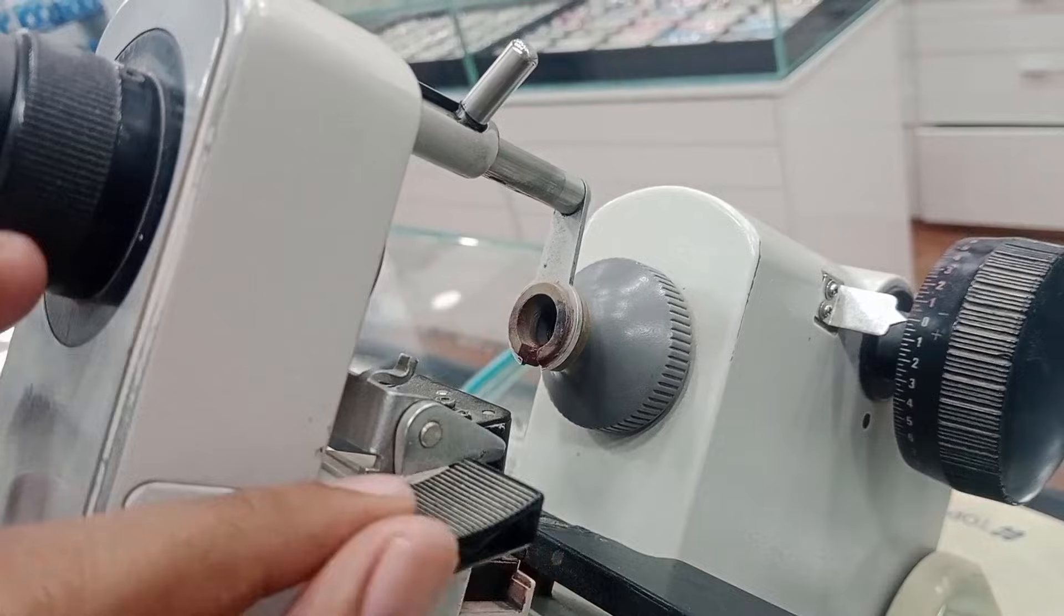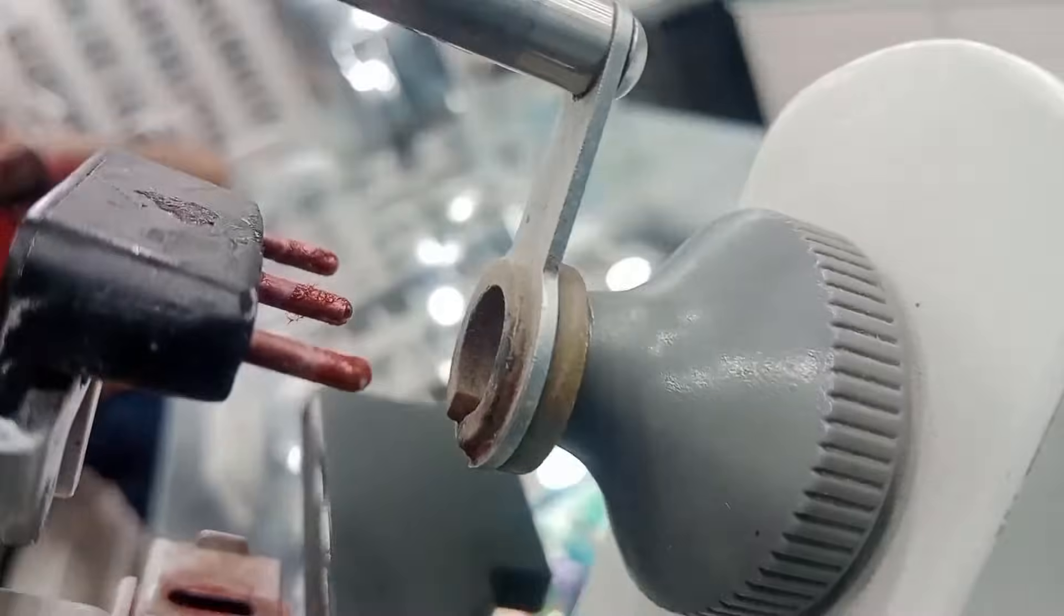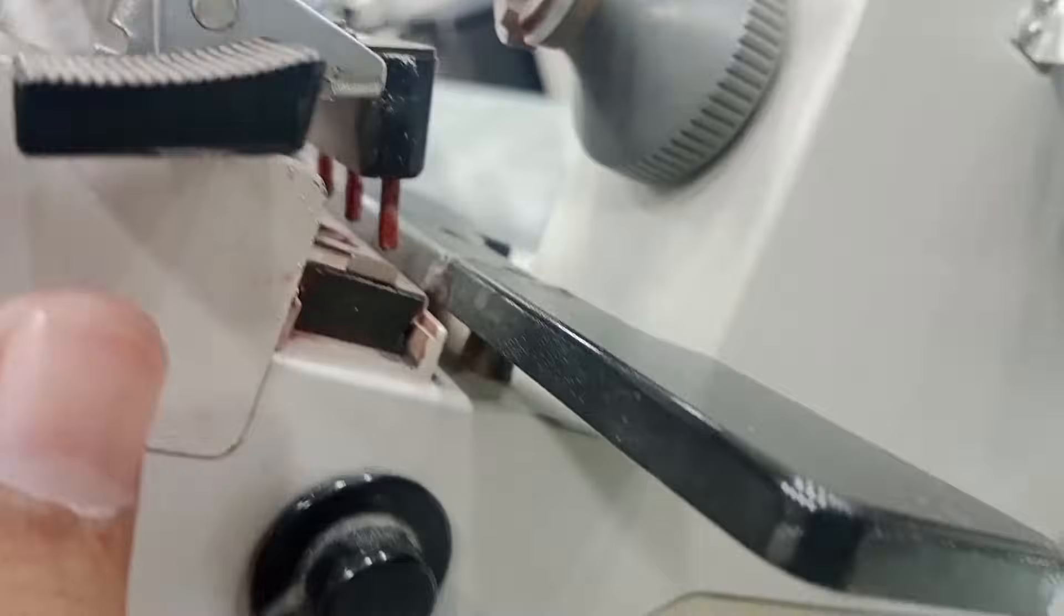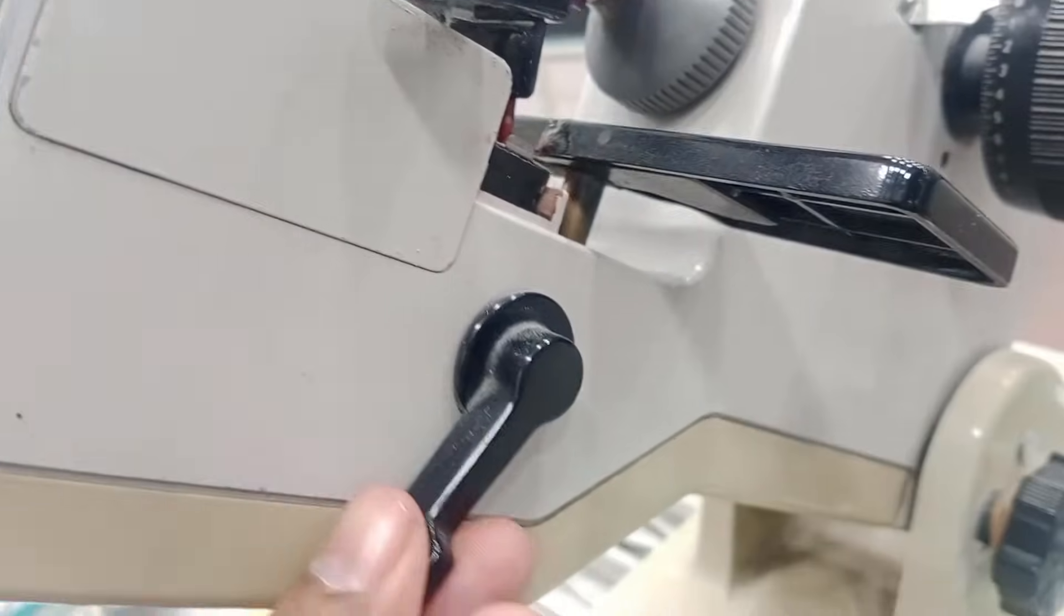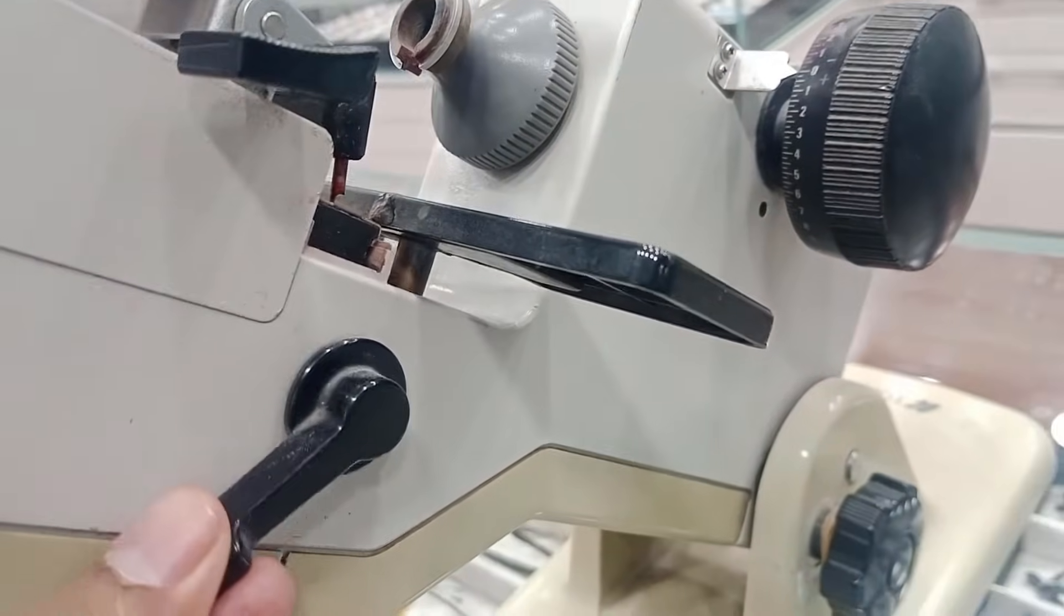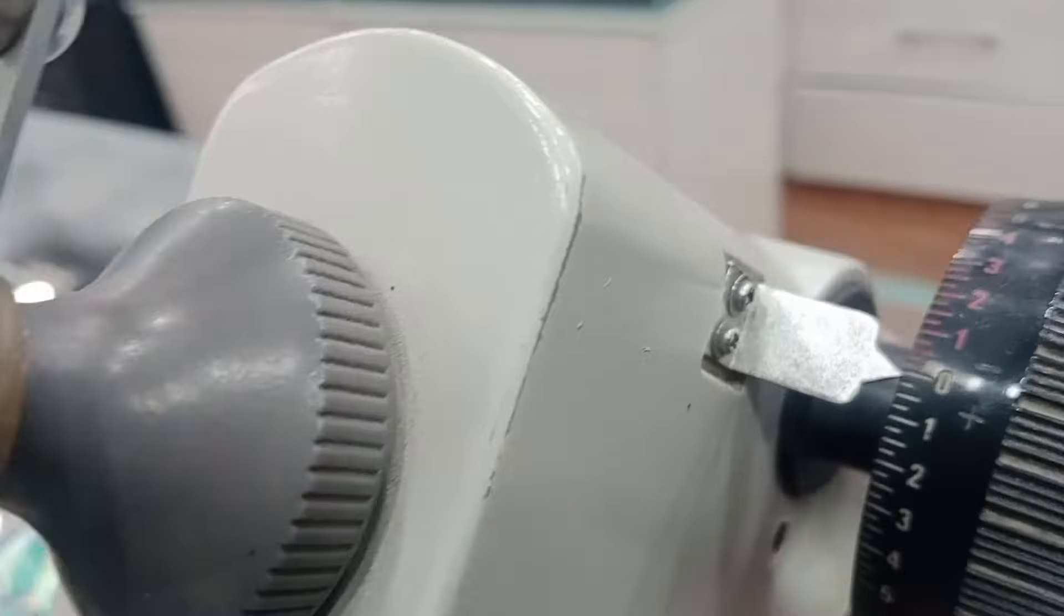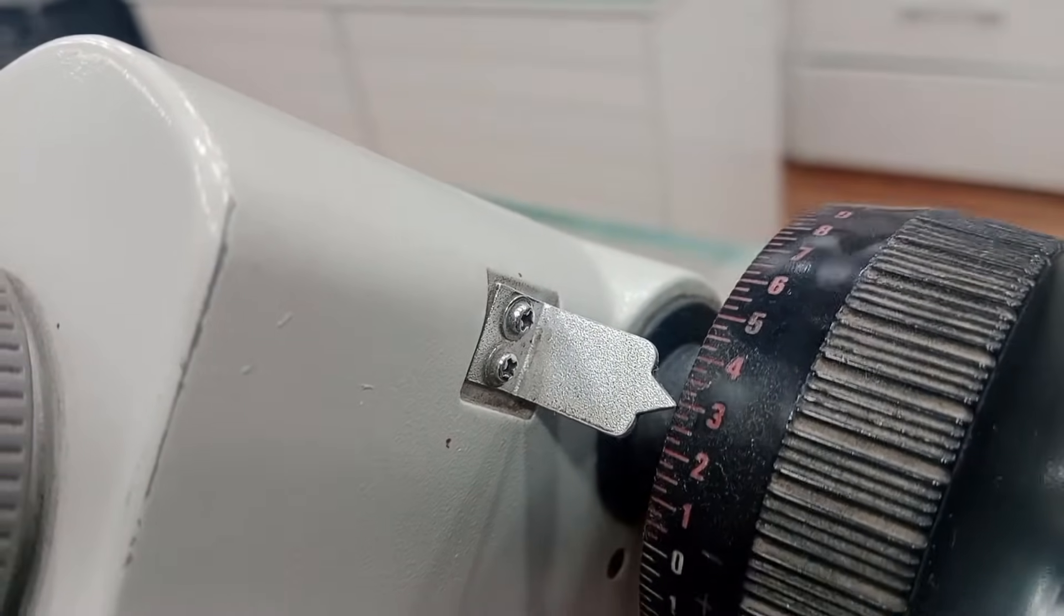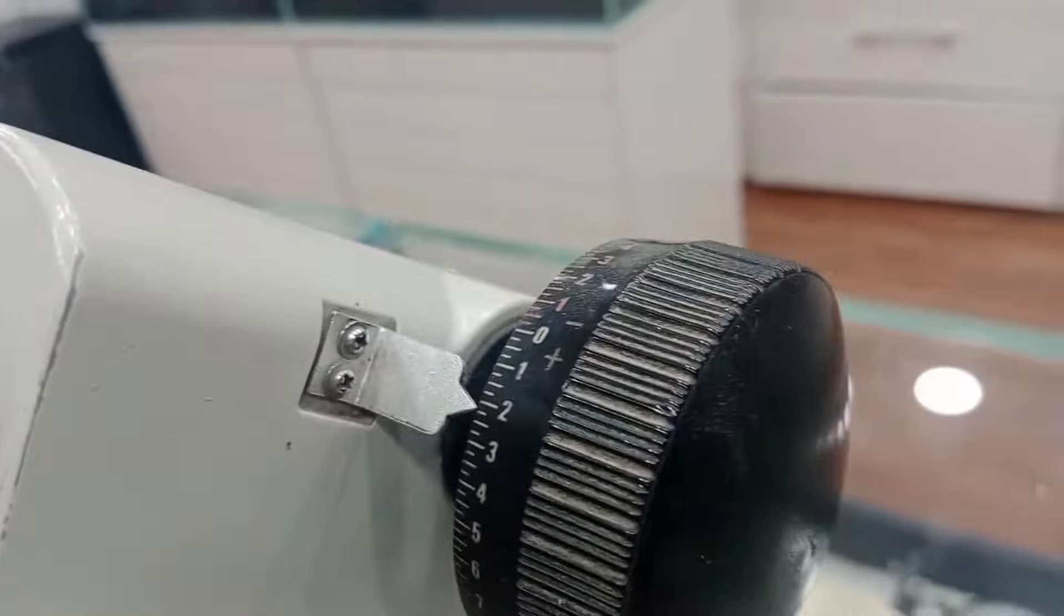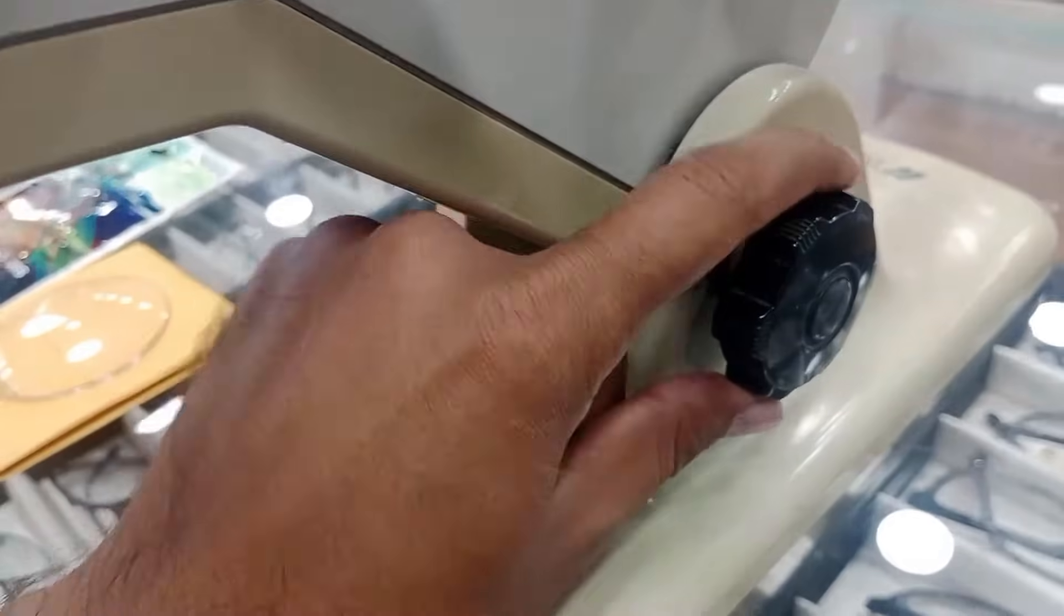And this is for axis marking. You can mark your axis with these markers, and this is to adjust the optical center of the spectacles or blank. And this is our power dial.